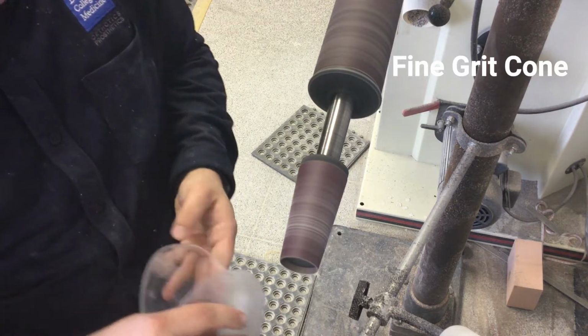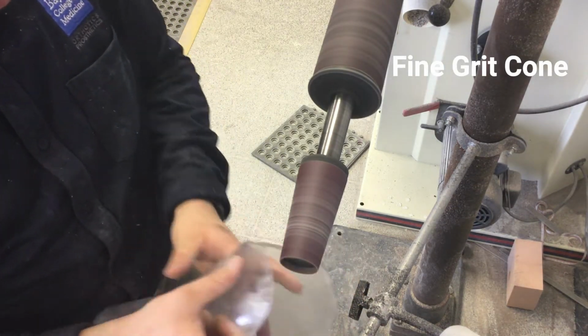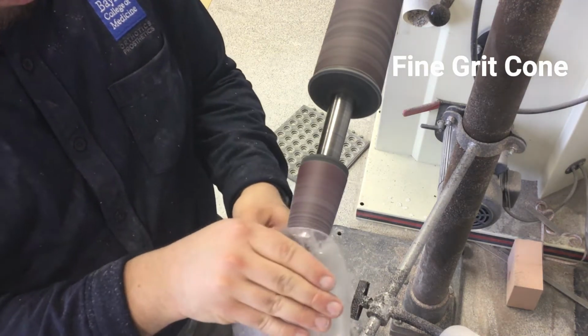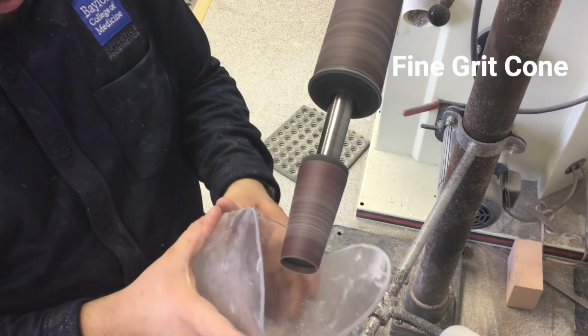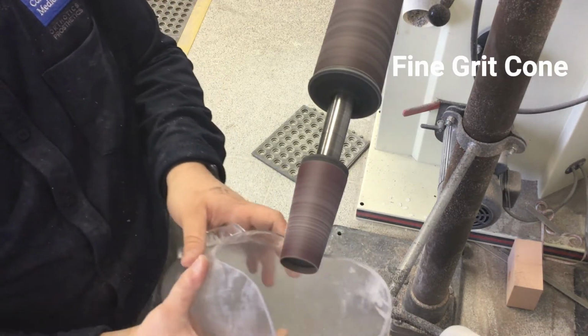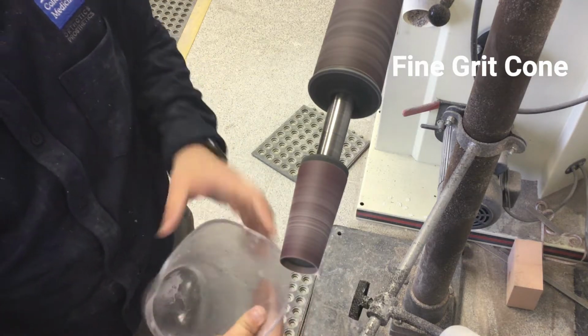Finally, we will do a gentle pass over the outside or exterior trim line of this socket. We will want to keep this final pass as close to the top trim line as possible to ensure the exterior of the socket is not damaged and there are no sharp edges on the socket.